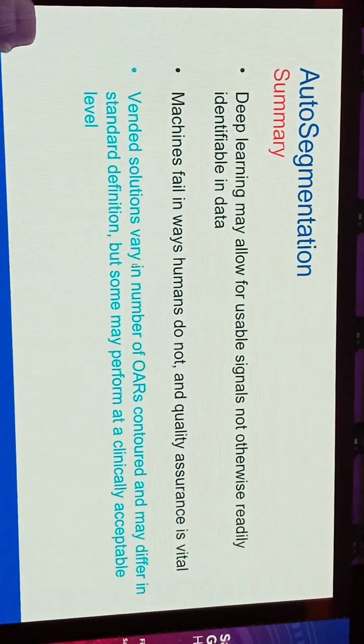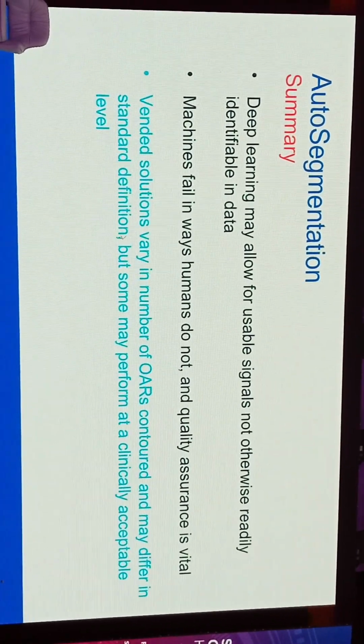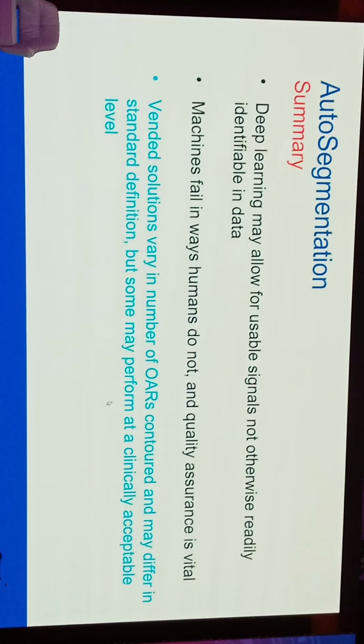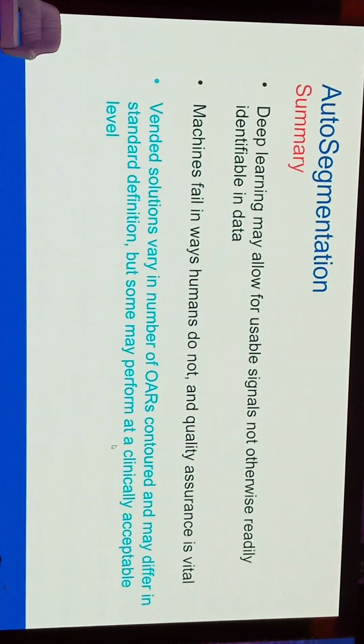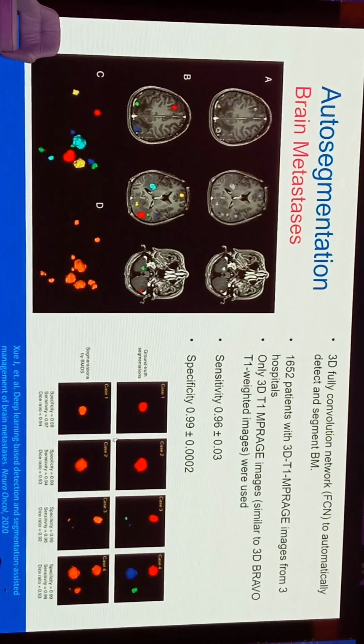So vended solutions vary in the number of OARs contoured and may differ in the standard definition and summary, but some may perform nevertheless at a clinically acceptable level and are likely ready for routine use as they're FDA approved.